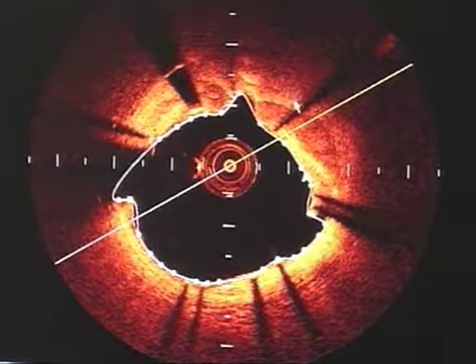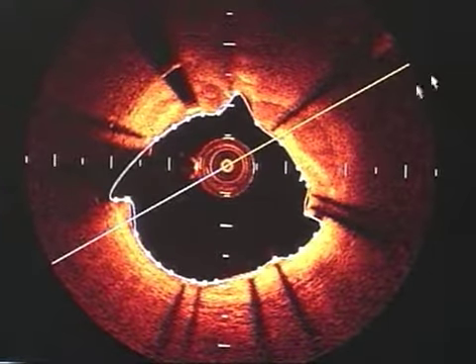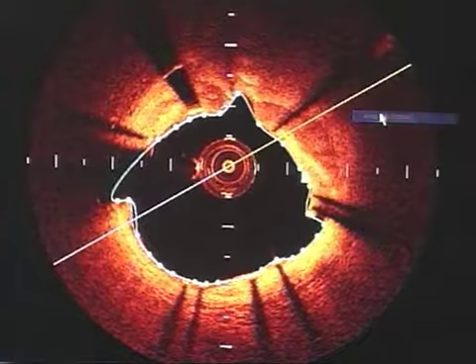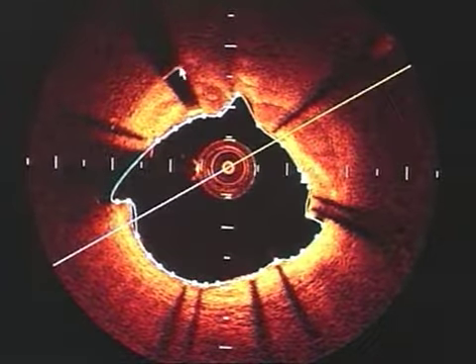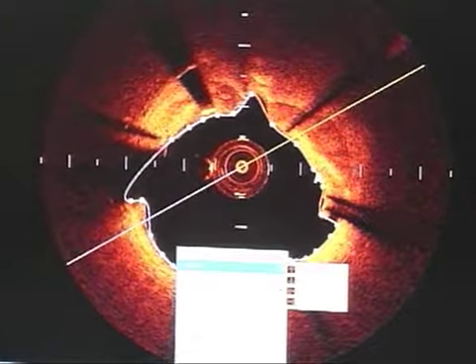But more important is, at 1 month, people need to know, we have learned that it takes about 6 to 8 weeks to properly endothelialize in the bare metal stent. In the DES, it takes about 4 to 6 months to properly endothelialize. You see, like a square coming in, to be on the safe side. That's why the initial FDA approval for double antiplatelet therapy was 3 to 6 months for each of the stents. So I wouldn't expect properly endothelialization at 1 month.